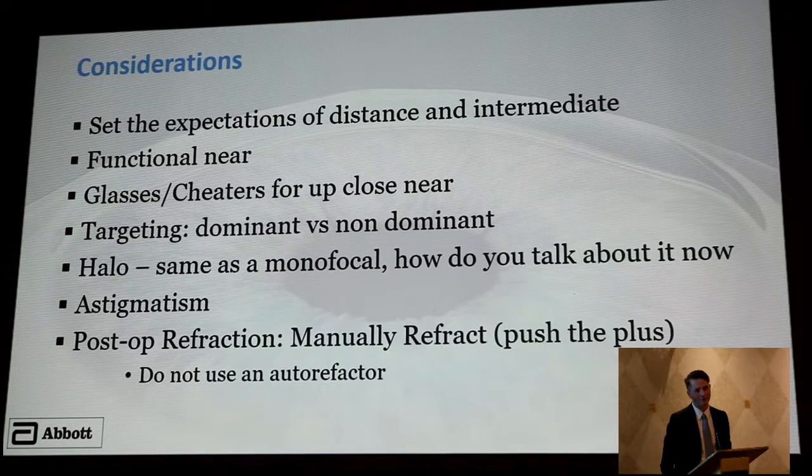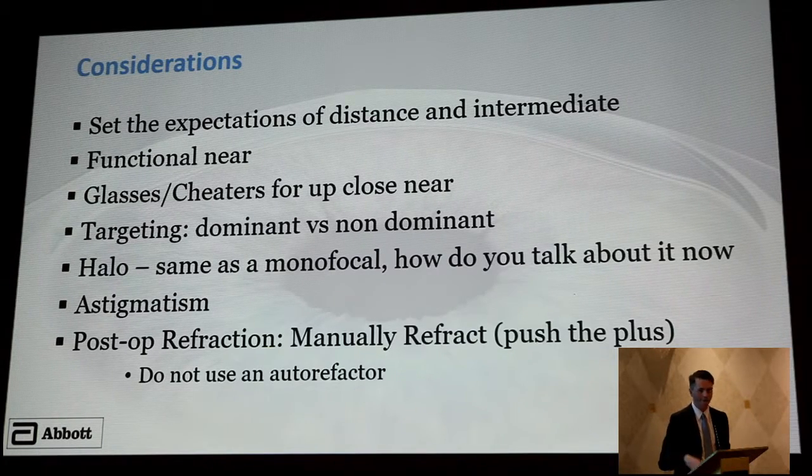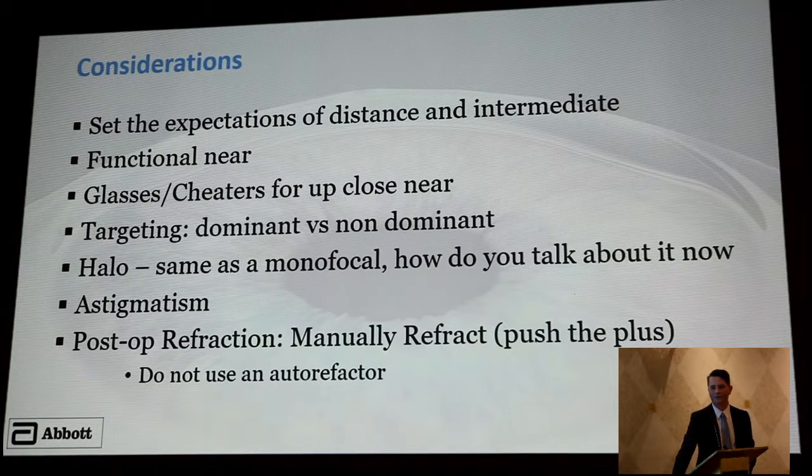And we market this to your patients to combine it with laser eye surgery, because we don't have the toric lenses. So when patients are coming to our office and they're talking about this, we're saying to them, look, we'll make you refractively neutral. So if they need to have their astigmatism treated, we treat that. We don't charge them for that. That's all in their package when they're buying this multifocal. So you can tell them with confidence that, okay, you've got the dioptric astigmatism, don't worry about it. Dr. Taylor will take care of it, and we'll laser that out. If they say -0.5 bothers them, we'll laser it out. So from that point of view, you should have confidence that the refraction will be exactly where you want it to be. Any other questions?